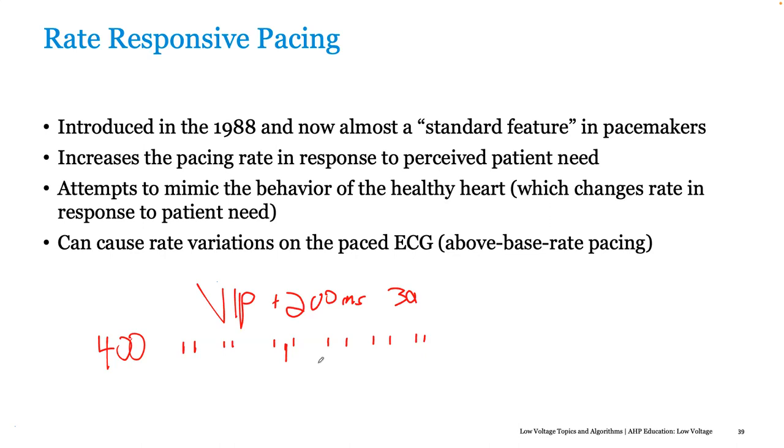So Julius, it's not in Sphera? No, you can have AAI to DDD, which does the same thing, the intermittent thing. If you're talking about managed ventricular pacing, to trigger that, AAI to DDD does exactly what MVP does.